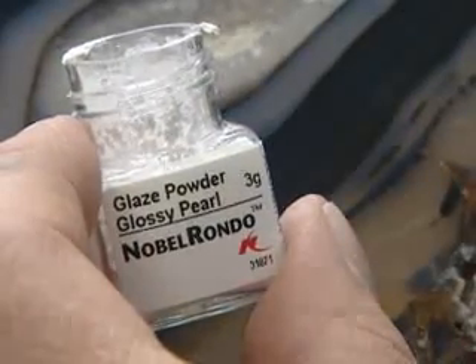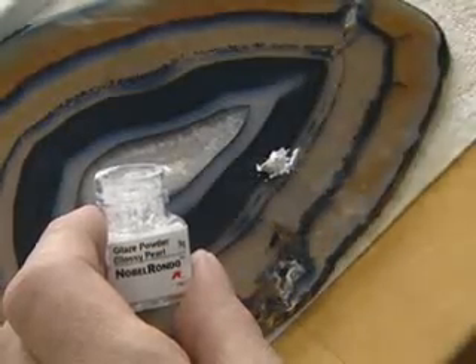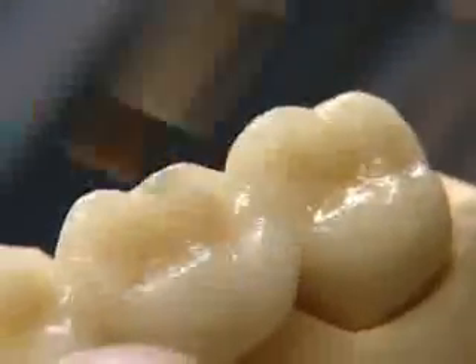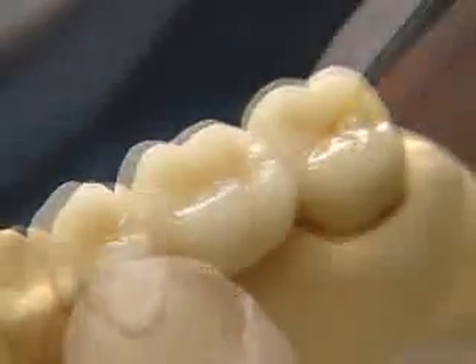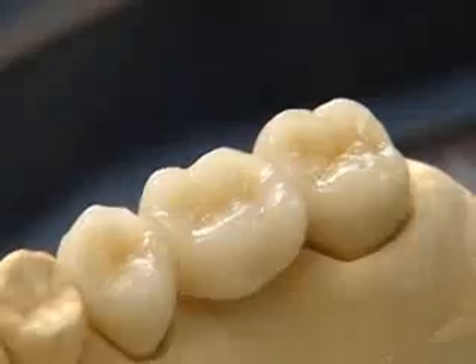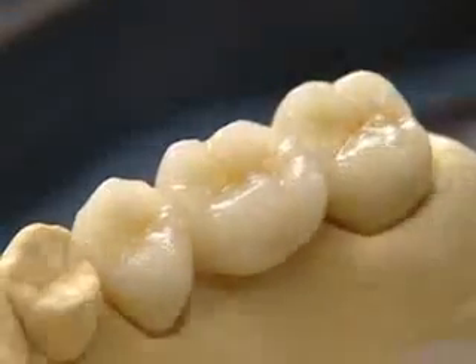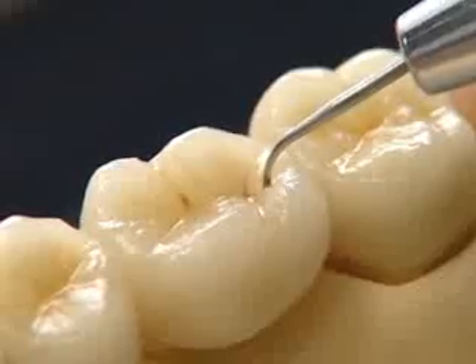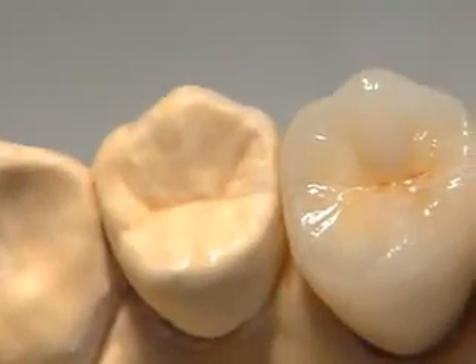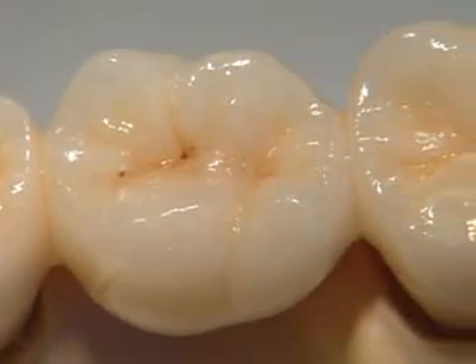When using extremely low amounts of glossy pearl glaze, the bridge is finally prepared for glaze firing. The Nobel Rondo paint colours are used only sparingly in the area of the occlusal fossae. The glaze firing at 895 degrees Celsius provides a homogeneous surface without the need for additional mechanical polishing.